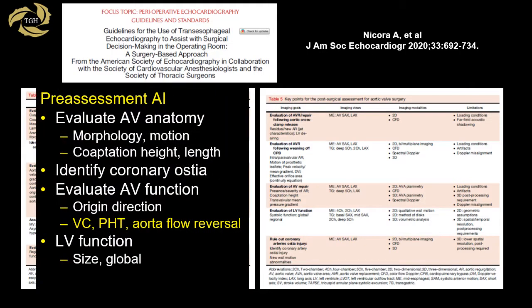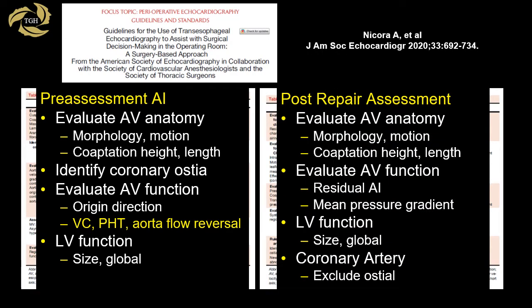In addition to the 2D and color flow Doppler assessment of the aortic valve as described above, the pre-aortic valve TEE focuses on aortic root measurements, aortic cusp motion, the level of cusp coaptation, coaptation height, and analysis of the AI jet direction. Simultaneous multiplane imaging allows scanning of the cusp edge and more precise localization of lesions, particularly useful in differentiating between non-coronary and left coronary pathology.